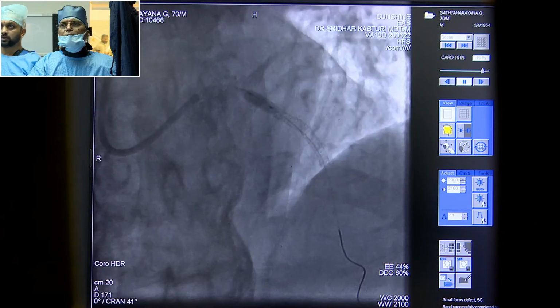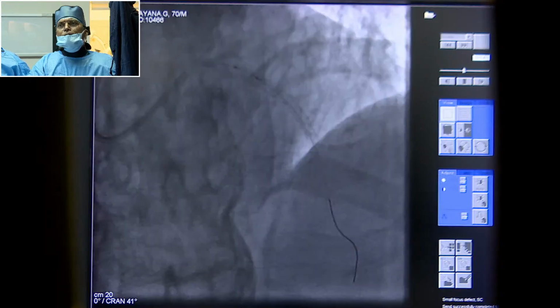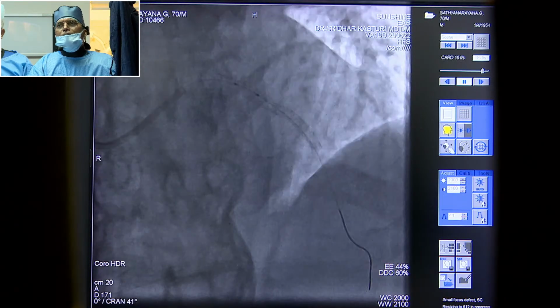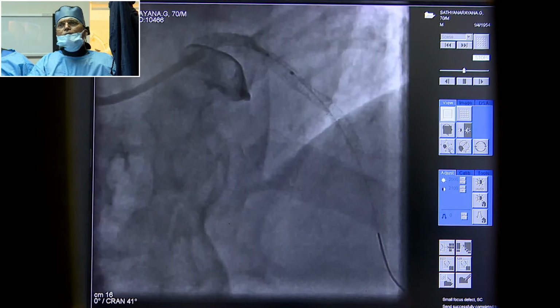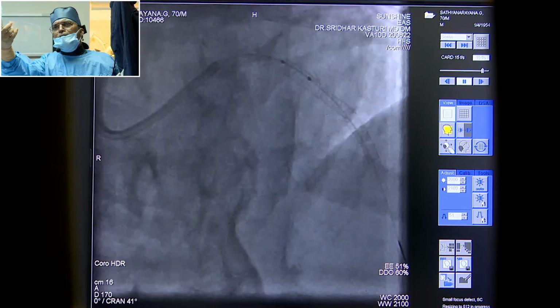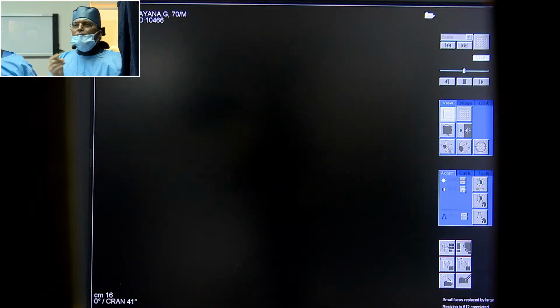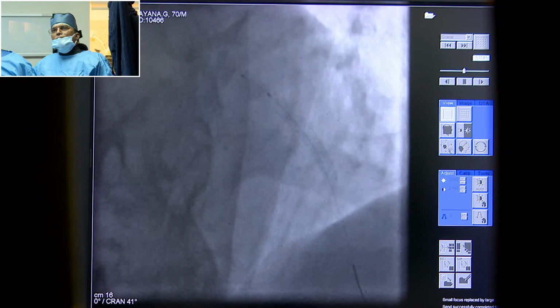Not beyond the edge, right? No, sir. Come out. Inject. Correct. Inject. Fine, it is done, sir. While disengaging, while pulling the balloon, engage the catheter. Otherwise it will get engaged while inflated. Distally inflated.